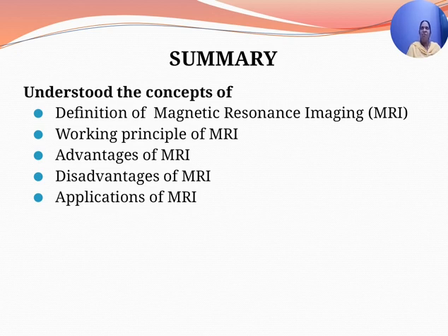They make use of a combination of both. The magnetic resonance imaging technique makes use of the RF region of the electromagnetic spectrum to provide an image of the body, consisting of millions of atoms.